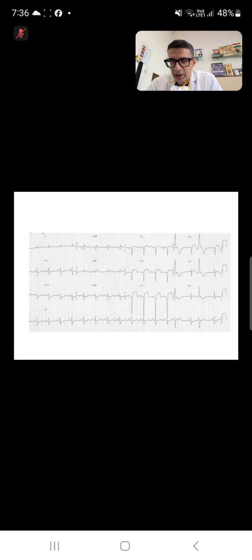Say the right coronary artery, RCA, has produced an inferior wall STEMI with ST elevation there, and the blood is now supplying the LAD, which also has a tight stenosis. When this gets occluded and that area is ischemic, you can have ST depressions in the anterior leads. So reciprocal changes could be pure reciprocal changes, or ischemia at a distance, or ischemia in more than one territory. So that's what was mentioned.